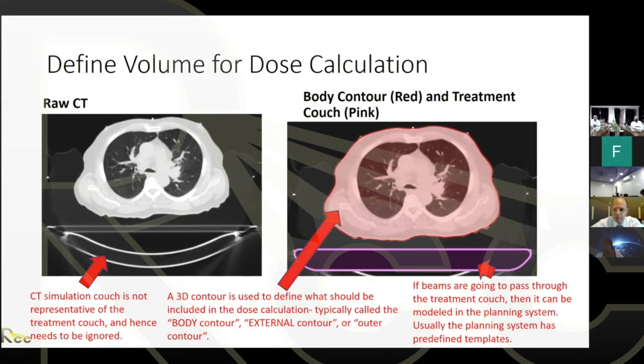Justus, another question. Yes. Why can't we use MRI for planning? So I think the question was MAR, which is metal artifact reduction, which is fine. Sorry, because I said Muhammad, do you mean MRI? And then Muhammad said yes, thanks. I'm not sure actually. Okay.